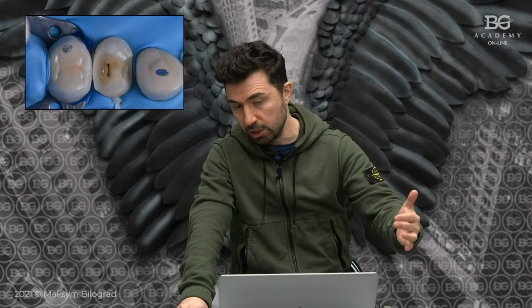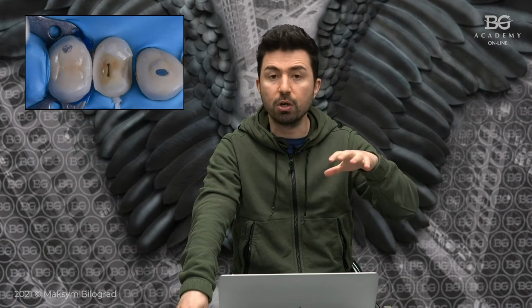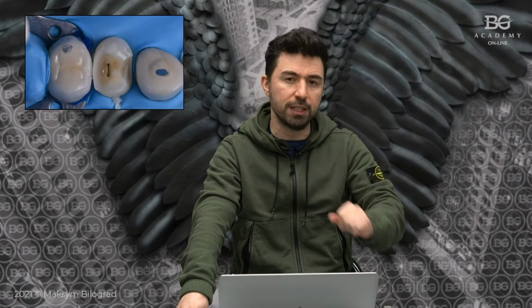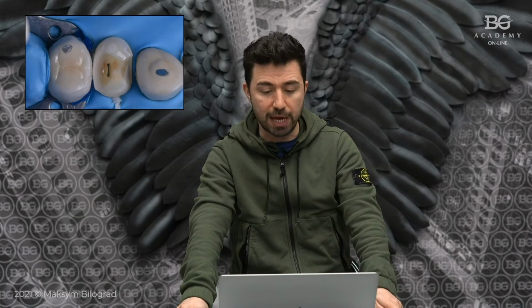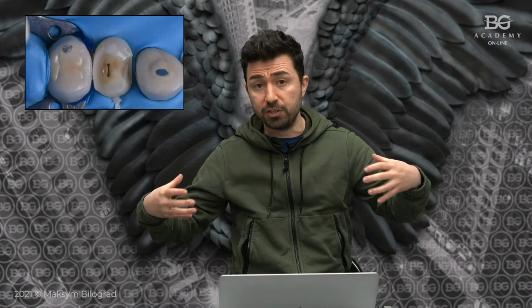Also, we have enamel from the distal zone, and I prefer, even in deep margins, to localize the margin for my indirect restorations in enamel, not in composite. So in this case I would not go for deep marginal elevation because we have enamel, and I was able to get access to that distal enamel.